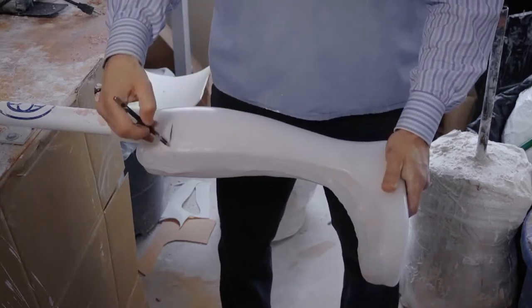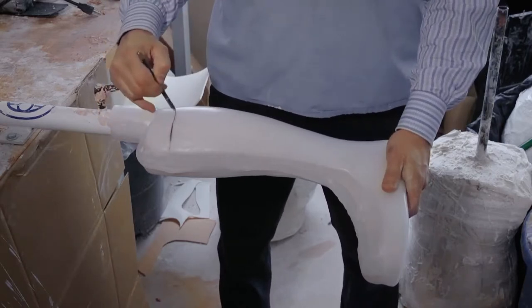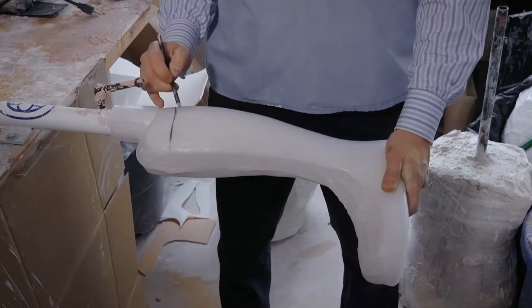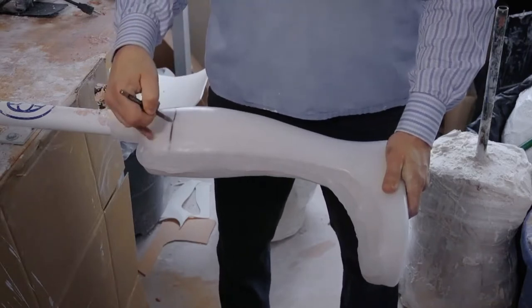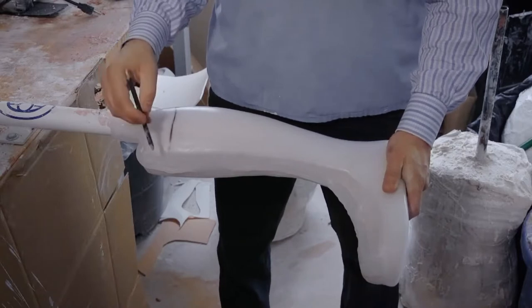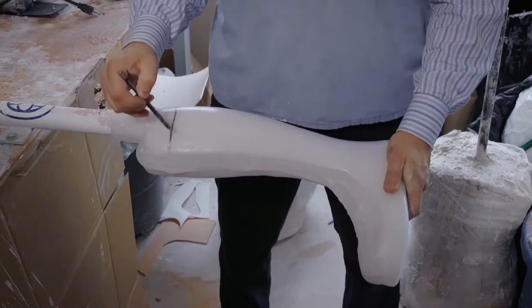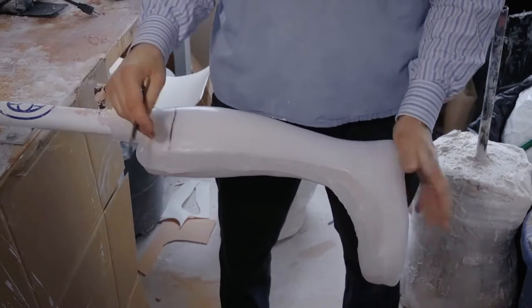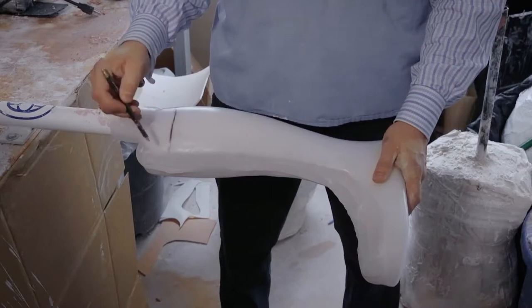So here we go. I have a height set right here. This is for our patient. And an orthotist will begin with the height in mind. Now, technically speaking, many people agree that the height of an AFO needs to be 20 millimeters distal to the neck of the fibula. Okay, so that's one way to look at it.